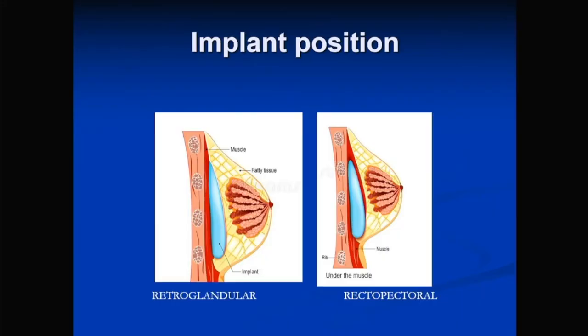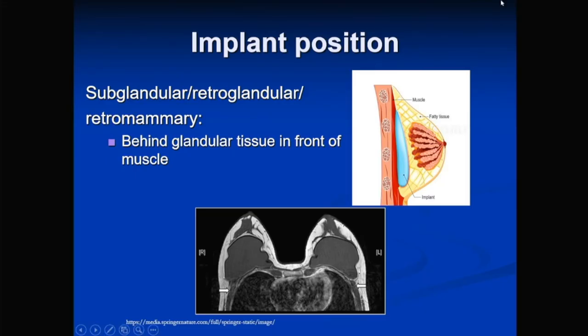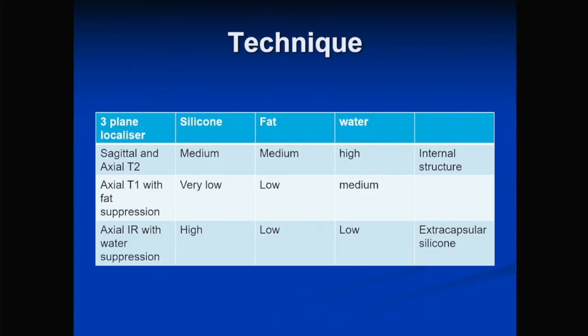We can differentiate implants by position: retroglandular (also called subglandular), where the implant is in front of the pectoralis muscle — the most commonly placed — or retropectoral, behind the pectoralis muscle, often done after mastectomy, where you can see the pectoralis muscle draping across the implant. The internal structure is best evaluated on sagittal, axial, and dedicated sequences. Extracapsular silicone is best seen on inversion recovery sequences with water suppression.